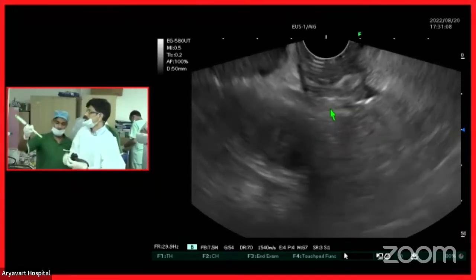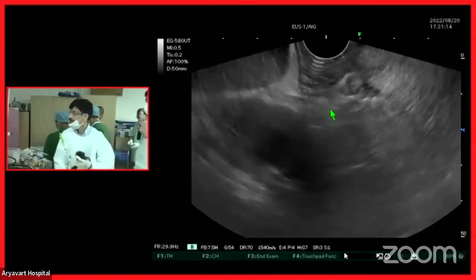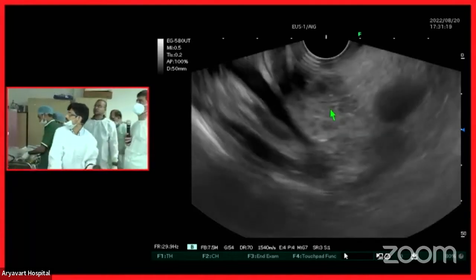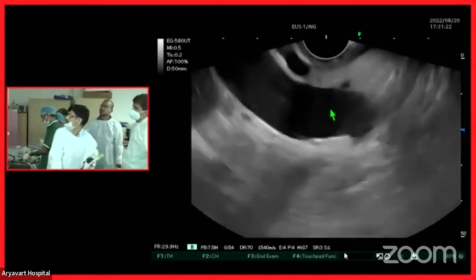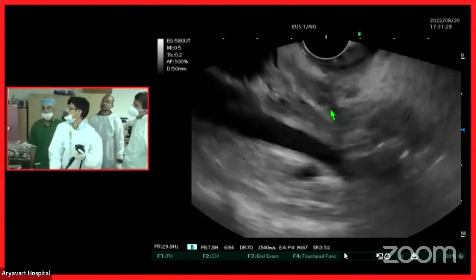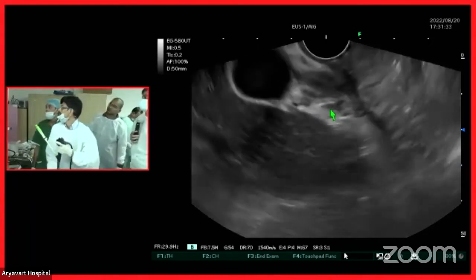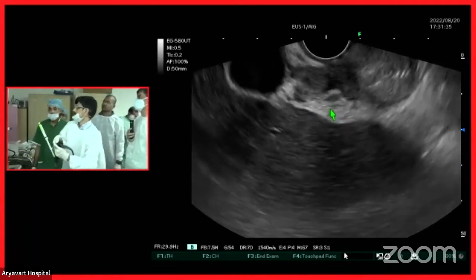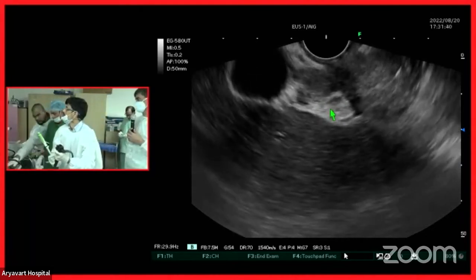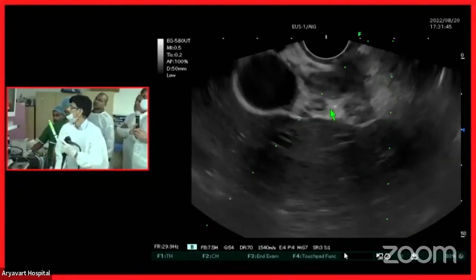Do you think we got the epicenter there, Vikram, with the first pass? Yes, I think the target was absolutely bang on. Okay, there it is. No, I'm good.